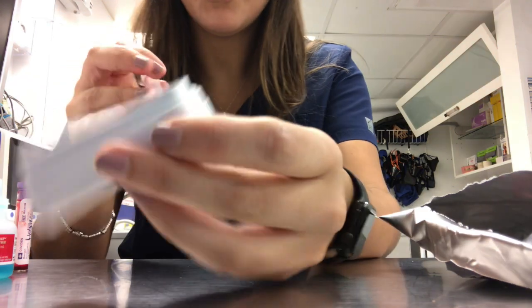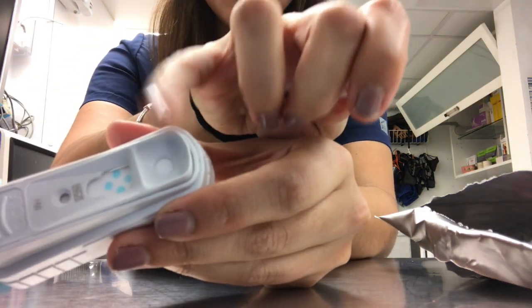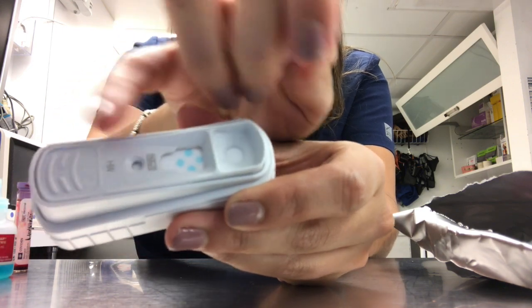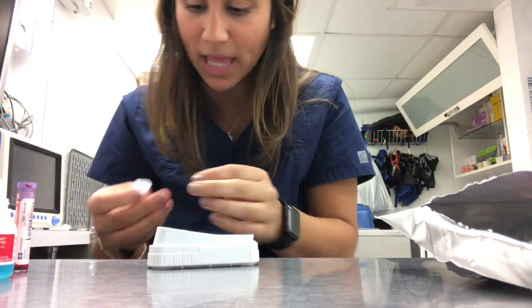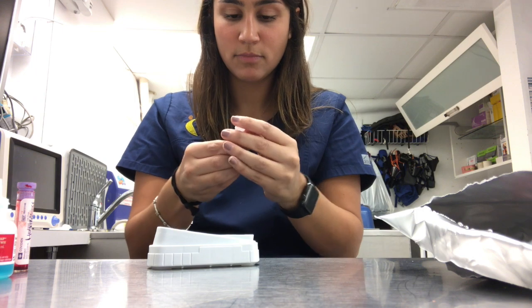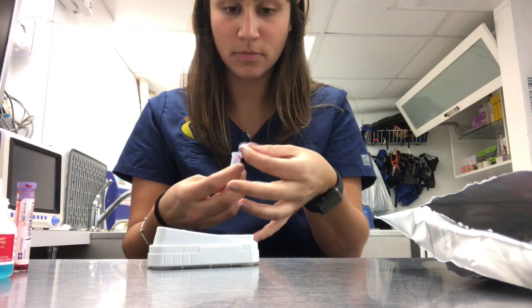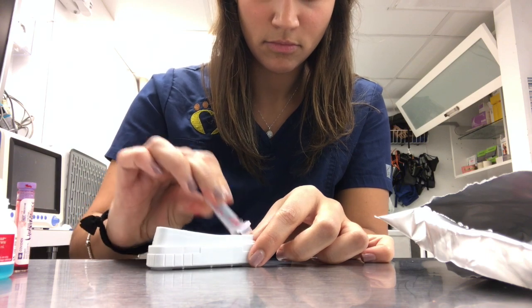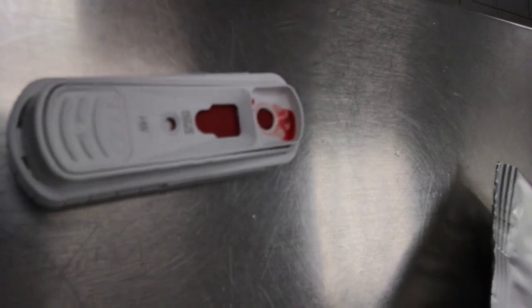Great. And I'm going to be putting it right in here. And then the blood will move up to here. And then once it hits this circle here, I will snap it down and then the test will begin. This test does take 8 minutes, so I'm setting my watch for 8 minutes and we'll read the result then.